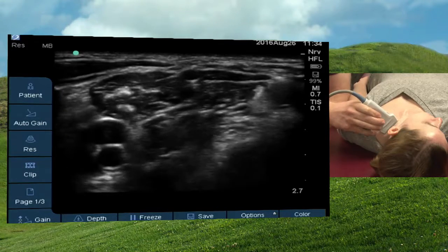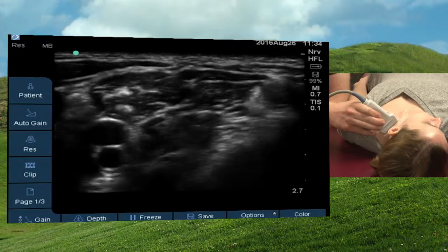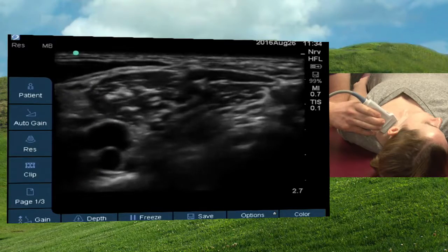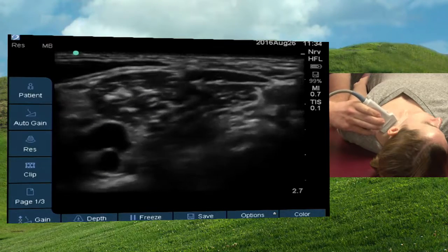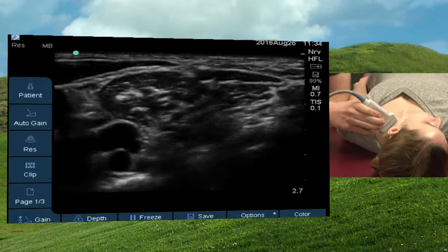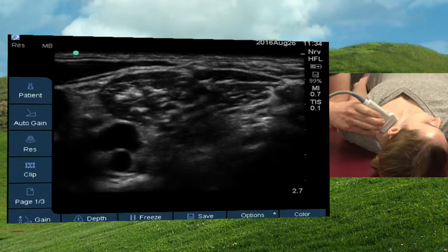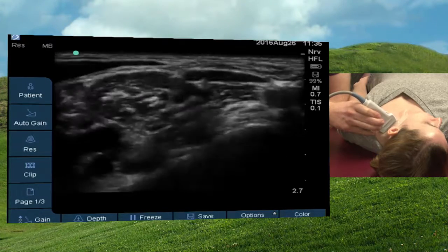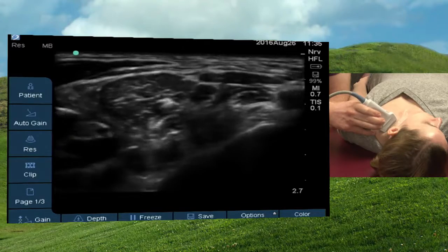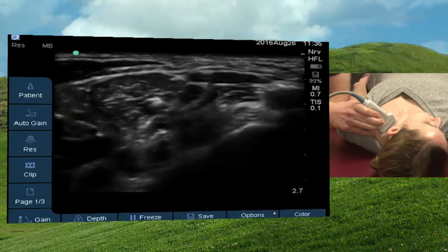So if you remember going back to the days of anatomy, and you remember your brachial plexus, everybody remembers the mnemonic Randy Travis drinks cold beers. And so right here, we're not at the roots, because there's 5 roots that then divide into 3 trunks. And so this is what we would call an interscalene nerve block, where there are the 3 trunks right there between the anterior and the middle scalene muscles.